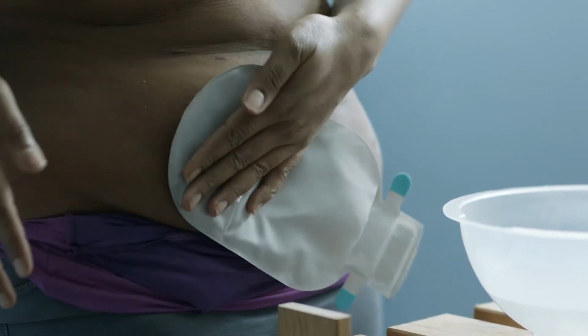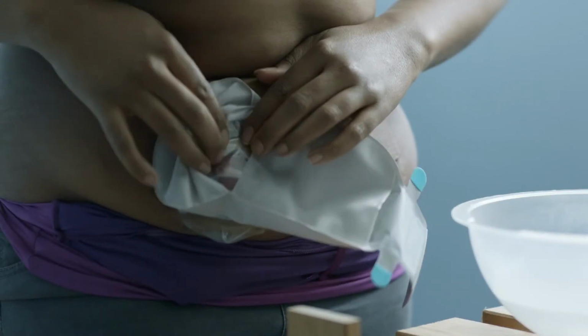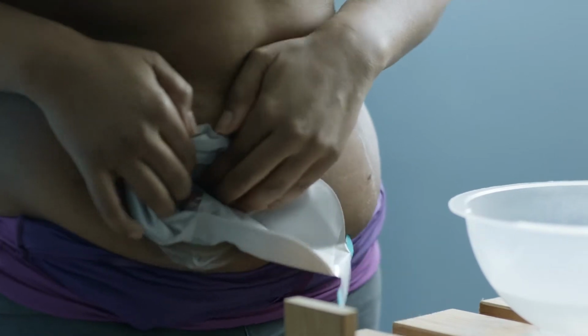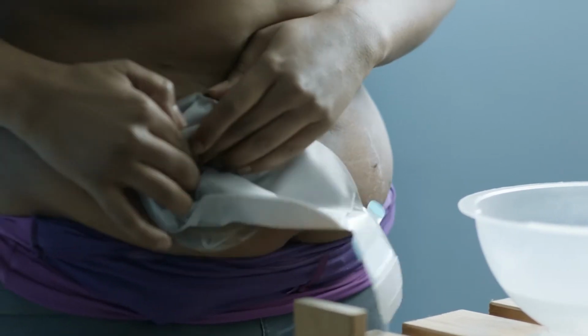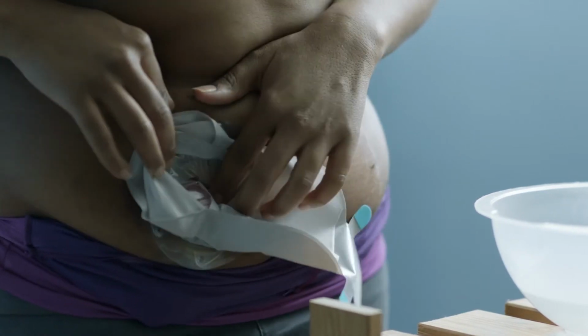I make sure that I press hard to make sure that it's completely sealed, that the adhesive is completely in contact with my skin. And then I press in the center where my stoma is to make sure that the bag is really connecting to the barrier ring so that that adhesive is nice and tight.